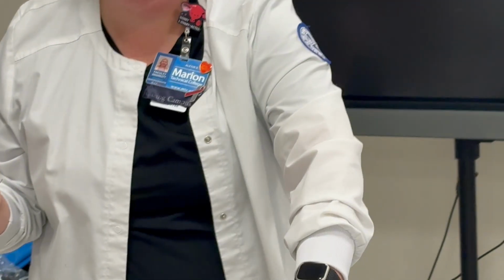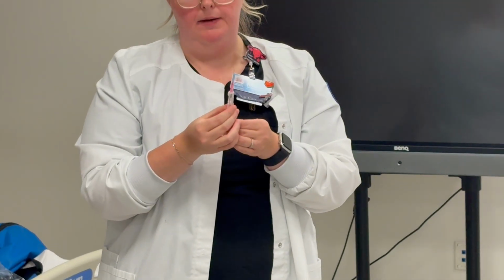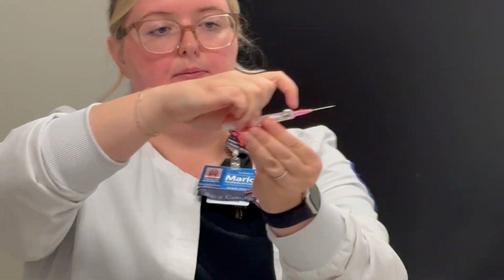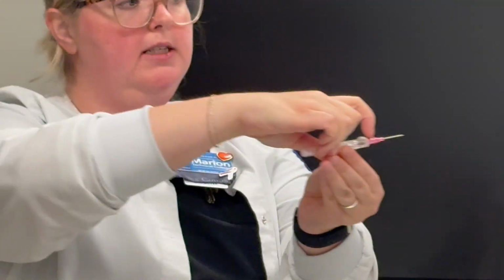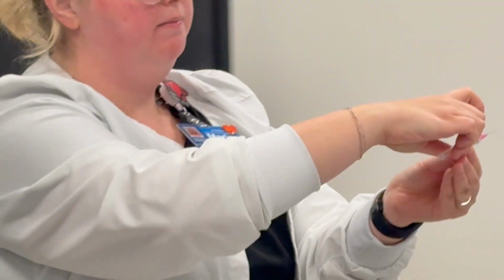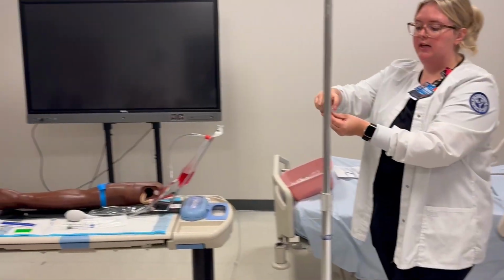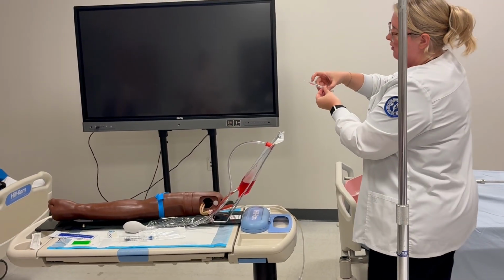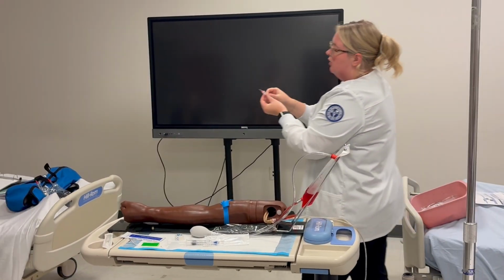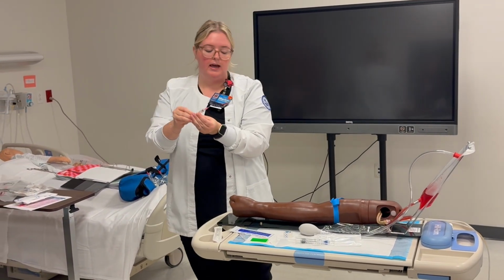I'm gonna take this off again. I have gloves on. We're gonna look at it, make sure that it's not damaged in any sort of way, okay? See this little part that sticks up right here? This part right here, see that? Everybody seeing that? That should be on top. This little guy. That is what you're using to manipulate and thread this IV, is this little notch right here, okay? Your bevel should be up so that the pokey part touches the patient first, okay?